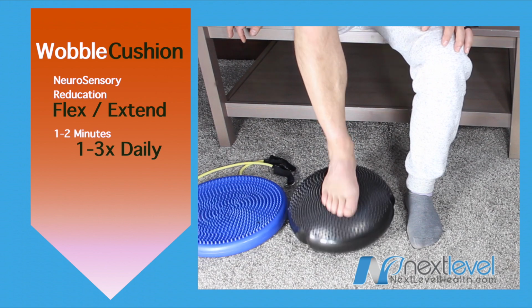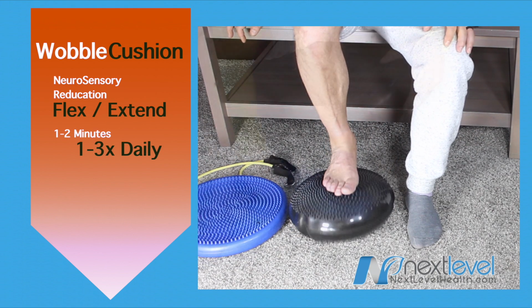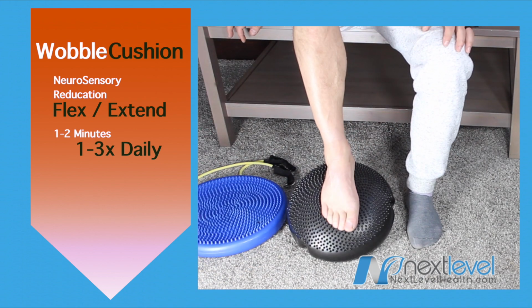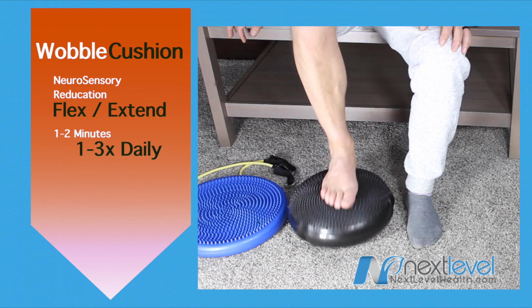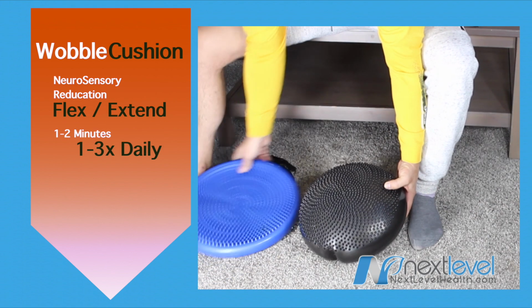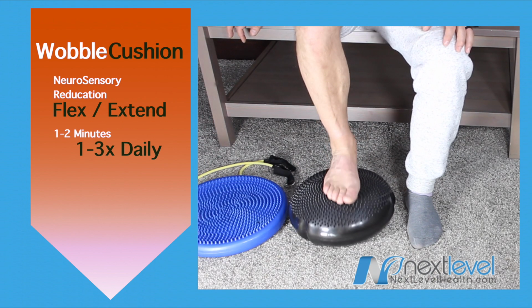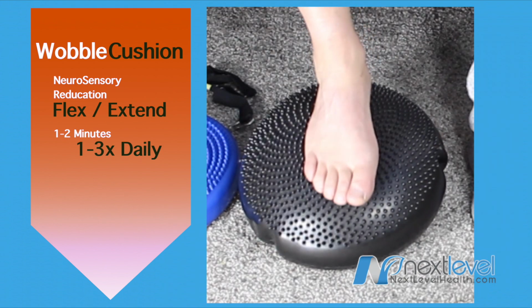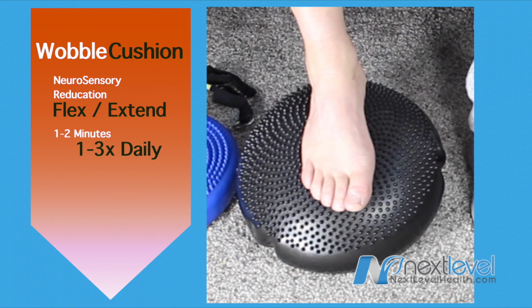In conjunction with that, you might as well grab your wobble cushion that actually has, if you'll notice, these little grippers. And I like that for sensory re-education. So while you're doing your calf rocker, you might as well just pull out one of your wobble cushions and use the one that has those little beads and knobs. Go ahead and use those.